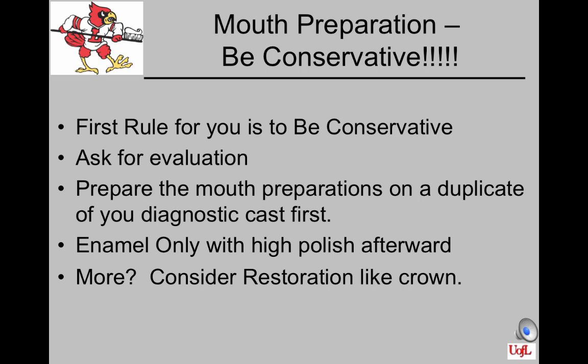First, I would prepare mouth preparations on a duplicate of my diagnostic cast. That way, when I go into clinic, I have an idea of the direction in which I'm going, and I can get an evaluation from the faculty member to start off and see whether I have the right track in my mind. Remember that you can only prep on enamel. If you get into dentin, it will require a restoration of some sort.